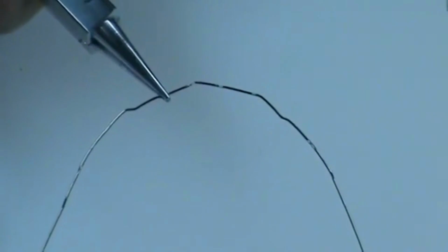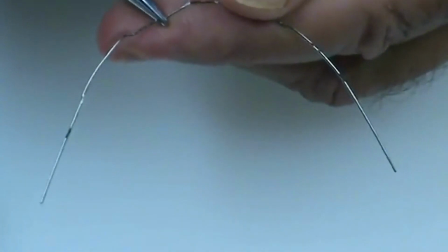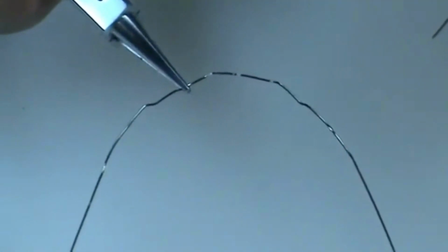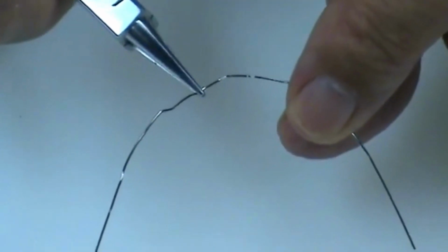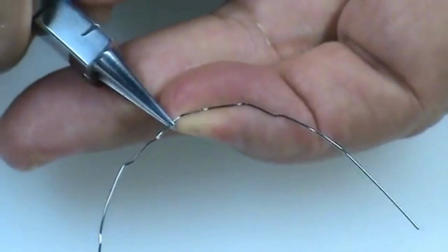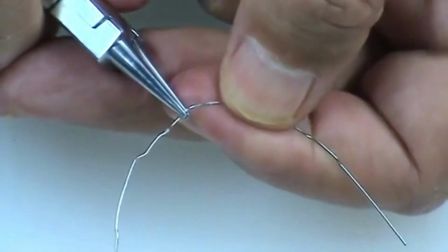I have my plier on 3-1 distal. So you can see I want to bend it up, not a lot, just a little, right? Okay, so maybe like a 10-degree bend or so. Okay, now the problem with this is that you can't always see your bend. Now the mesial of 3-1 has already gone up with that bend. And I don't really want to bring it down because I want the mesial of 4-1 to go up even further because the first bend was not enough.